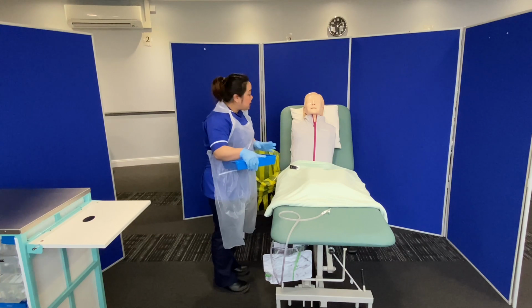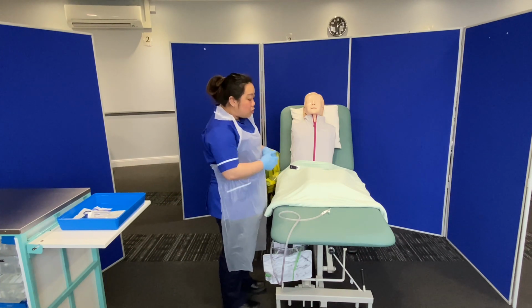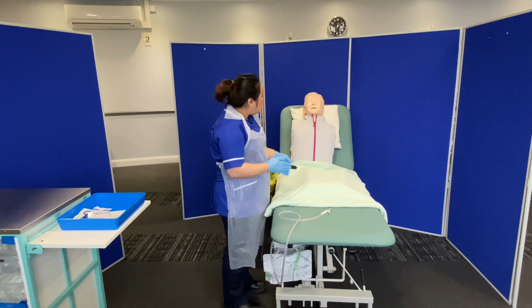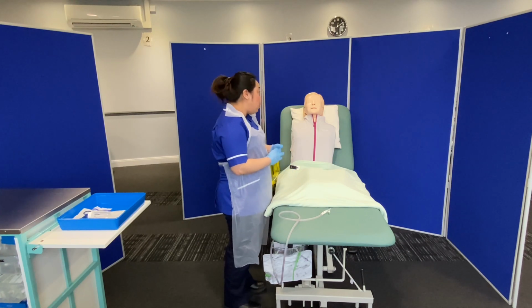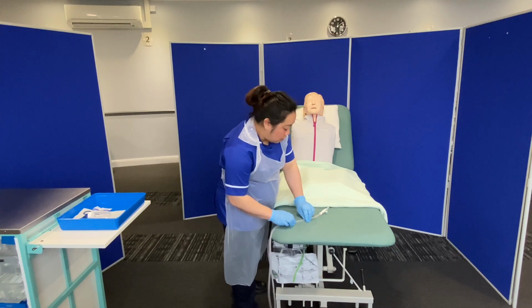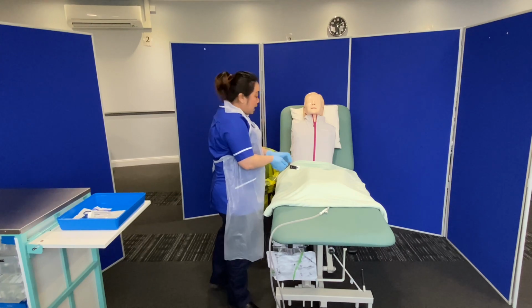I'm just going to put this aside, and I can see that you've got your catheter there. There is some urine in the tubing, so I'm happy to not manipulate that. But if there wasn't any, I would first need to manipulate it gently because sometimes there can be kinks in the tubing that might disrupt the flow of urine. So you don't have that. I'm just going to straighten this. Right, lovely. And then I'm going to discard my gloves, do hand hygiene and put new non-sterile gloves on, okay? Okay.